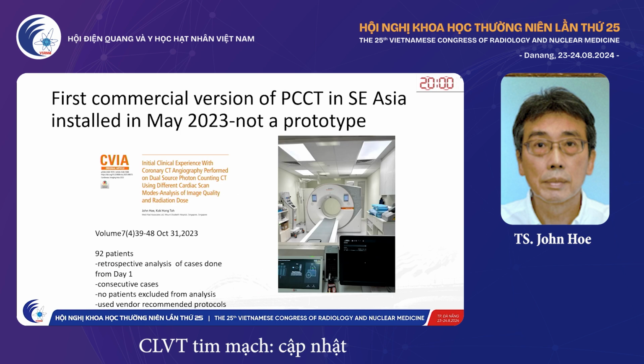I want to talk a bit about our PCCT scanner, which we installed in May last year. It was not a prototype, it's a commercial version, and we published our results of the first 92 patients that we scanned.